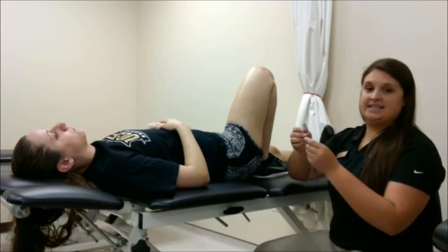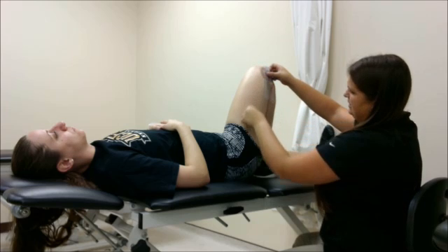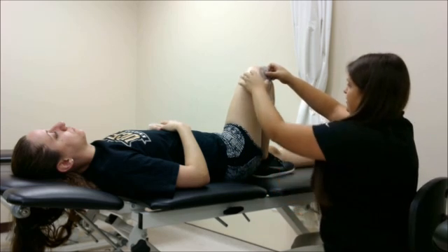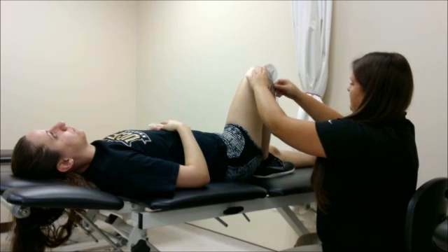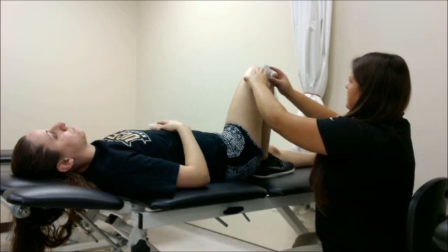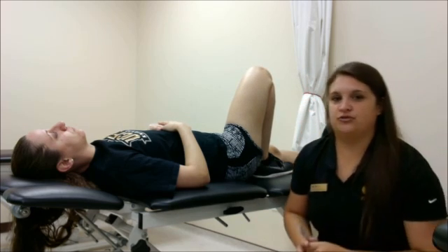I'm going to set the axis of my goniometer on the lateral condyle of her knee. The stationary arm is going to follow the midline of her thigh up to the greater trochanter. The movable arm is going to follow the midline of the shin down to the lateral malleolus. Here I'm measuring about 137 degrees of knee flexion, where 135 is normal.